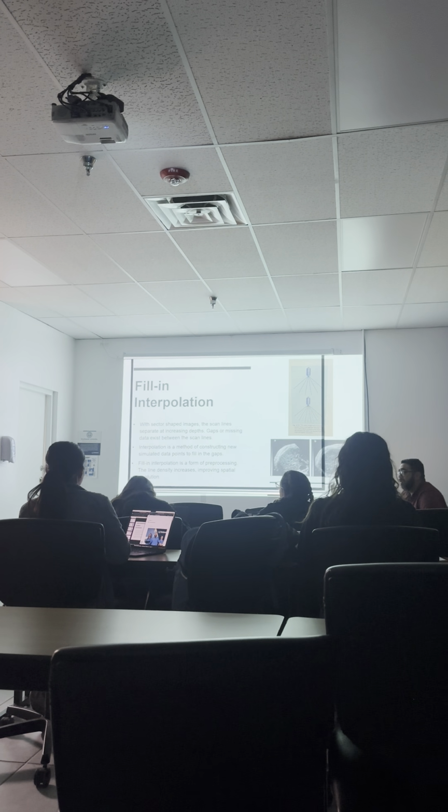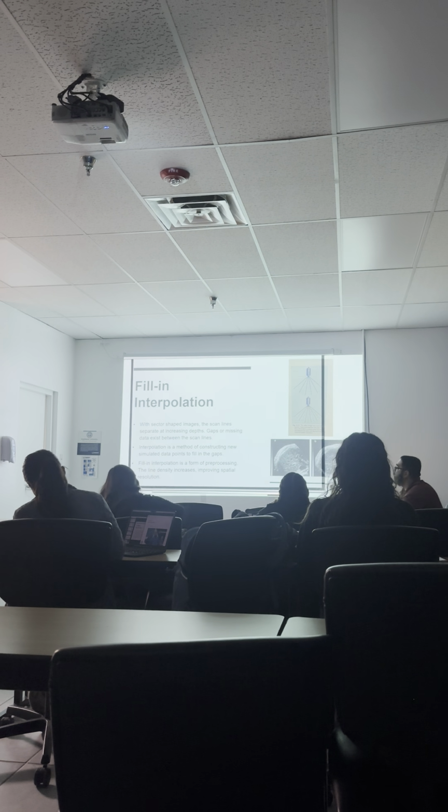And the system does that for us. We could change that with the line density. Increasing or decreasing the line density, okay?